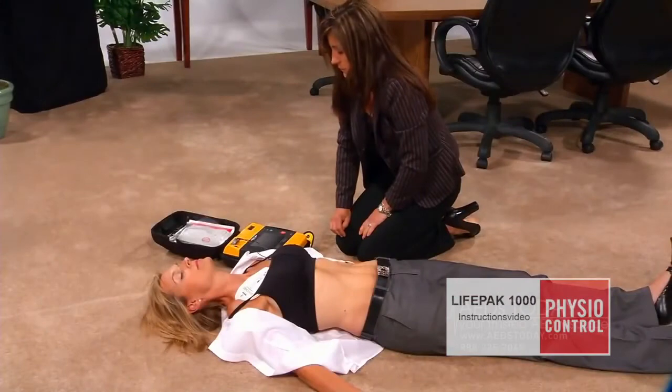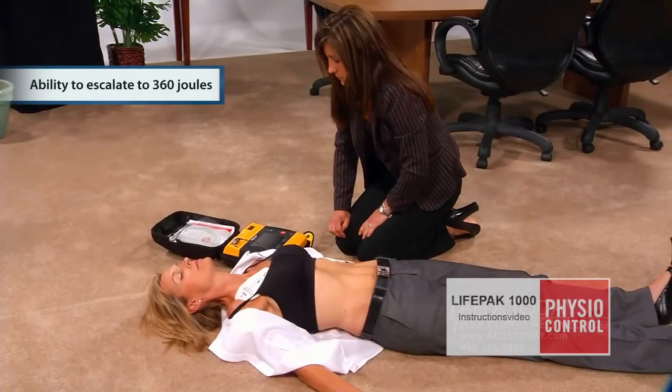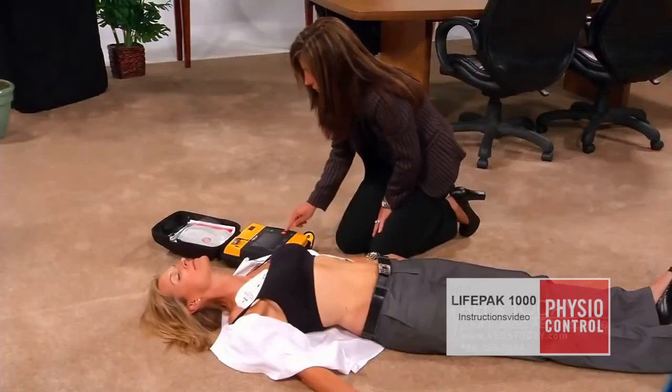Stand clear. The AED will begin analyzing. Stand clear. When a shock is advised, stand clear and push the shock button — press the red shock button.